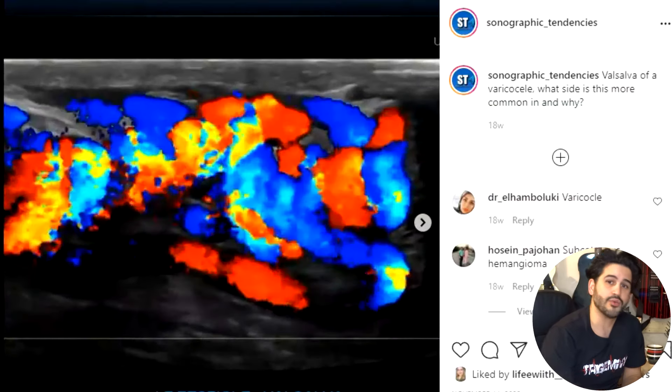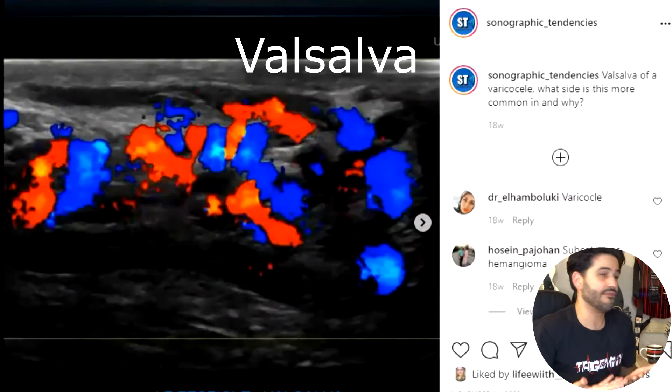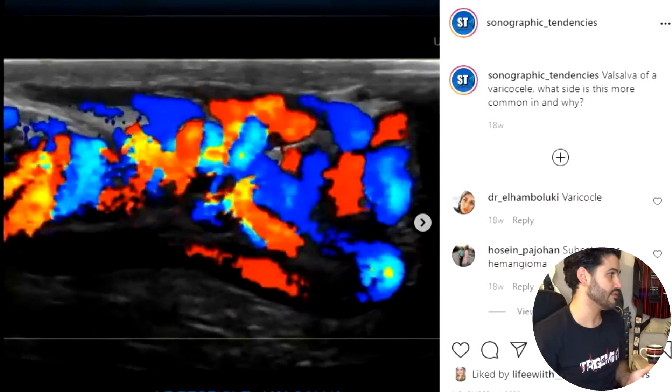Take that image with color doppler, then have the patient do a Valsalva maneuver to increase blood flow to the varicocele — have them take a deep breath, hold it, and bear down as if defecating or popping their ears. That should make the blood flow increase. For a baby who can't follow commands, you can press gently on their abdomen to increase intra-abdominal pressure, and crying itself will also simulate a Valsalva maneuver.